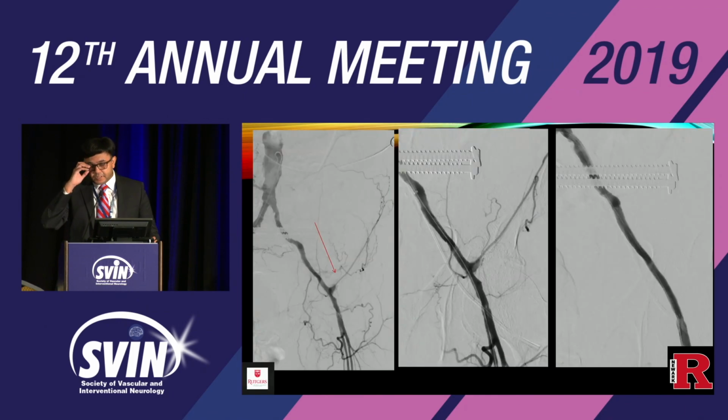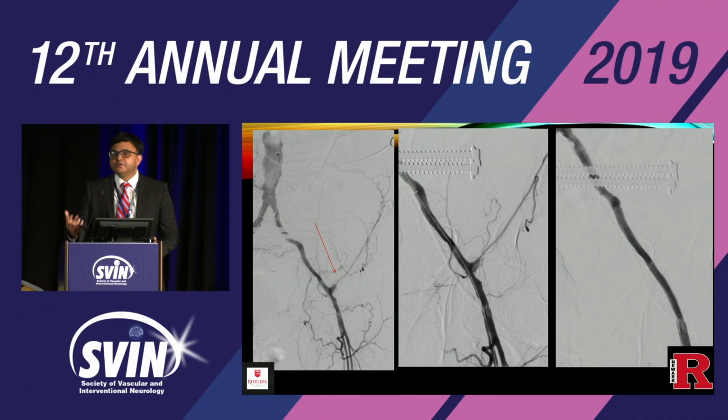Thank God we have great body colleagues. They shot an angio from the other side, and you can see there's a contrast extravasation right there. They went in quickly and put a covered stent. This patient survived. But that made me think there is a better way of doing things. So why take a chance? It may happen once in 6 months, once every year, or once every month.